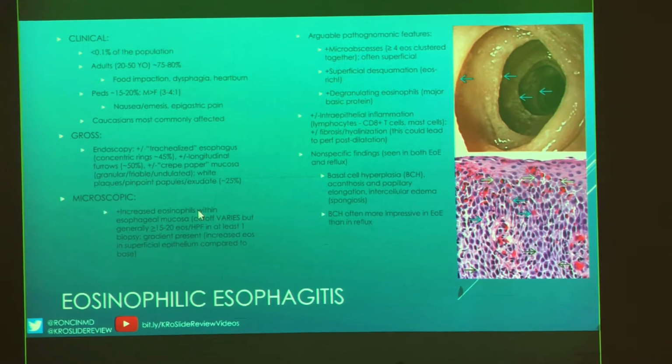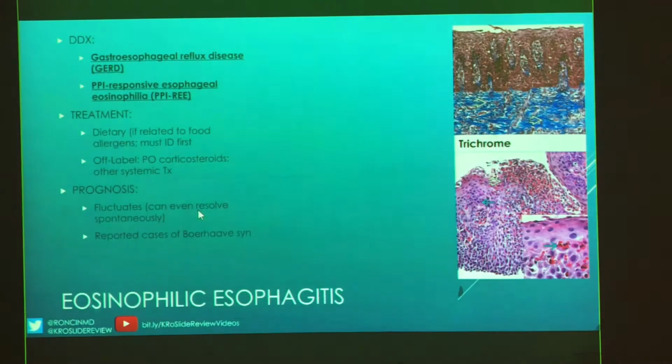Another thing to consider too is that if they've been dilated, they could perforate the esophagus after they've been dilated. And then I have some of the findings here listed for eosinophilic esophagitis and gastroesophageal reflux disease. And in the handout, when you guys pull that up, which is attached to this presentation in Path Presenter, I do have GERD in there for you guys so that you can compare that. Lots and lots of EOs in those pictures.